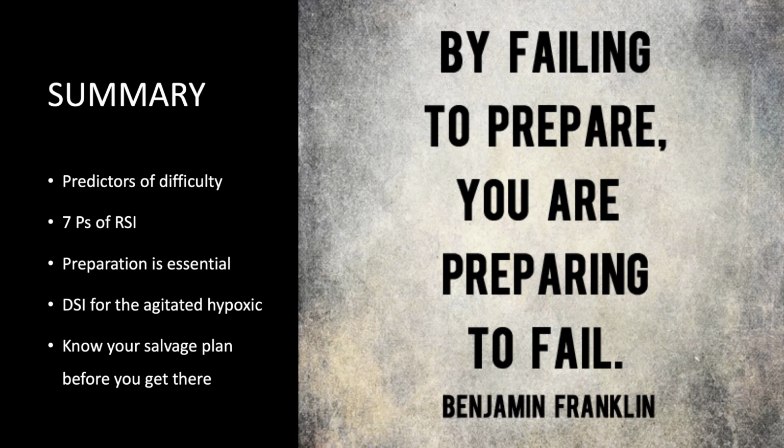We're going to talk about this much more in another screencast. We didn't talk about it during this one, but just recognize that in hypoxic patients who are agitated, taking time to pre-oxygenate them adequately is important. And again, we will review that more in different screencasts. Knowing your salvage airway plan before drugs are pushed is very important, both for your mental model and your team, so that everyone knows the next step when an airway attempt fails.